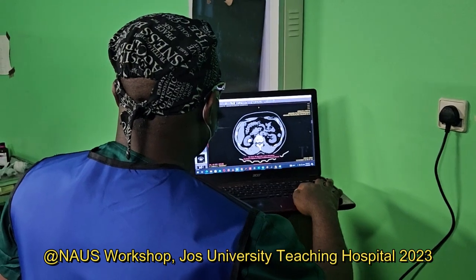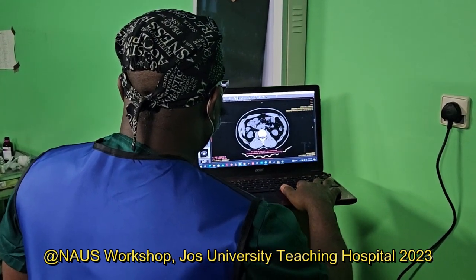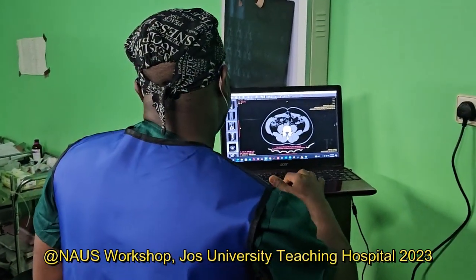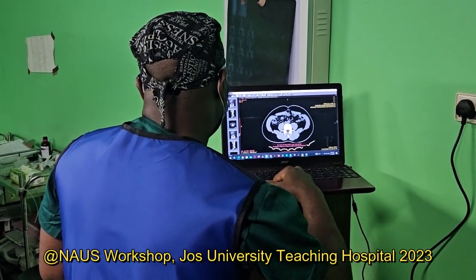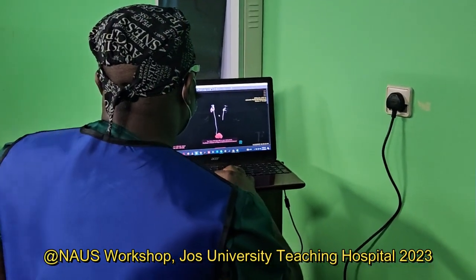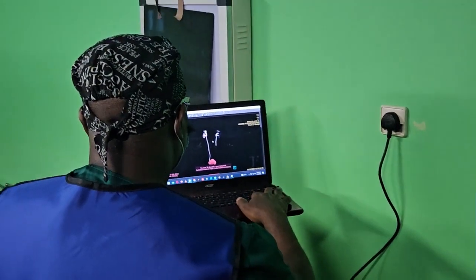So it's a three-dimensional system. That's the stone. Having viewed your image in all these dimensions, sometimes you might need to look at the digital subtraction, which is usually the last. So the digital subtraction image gives you a fair idea of the pelvicalyceal tree.